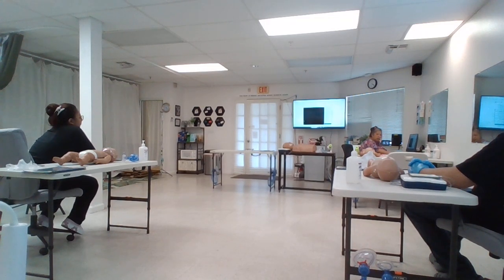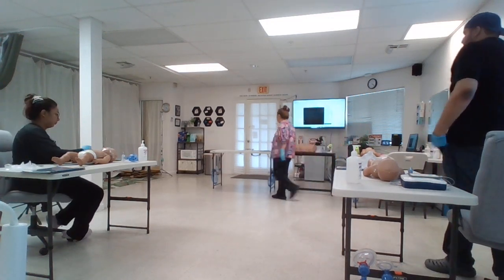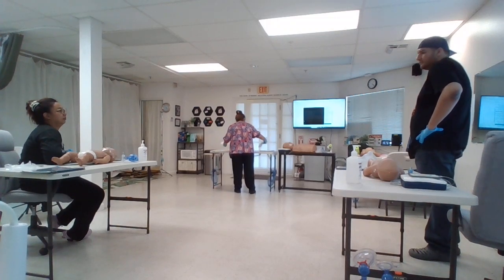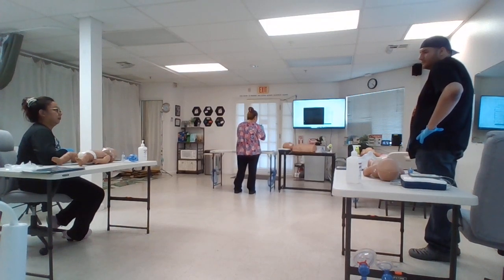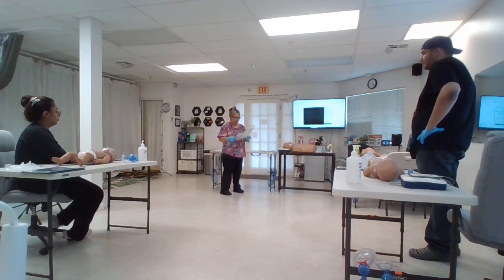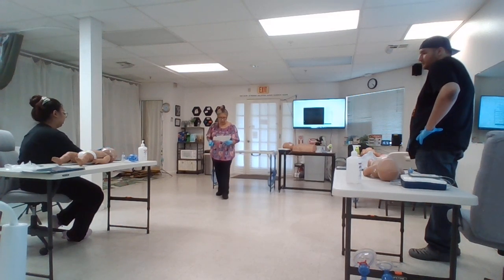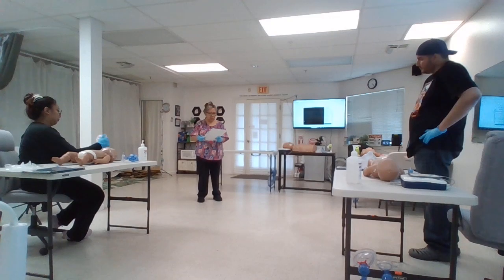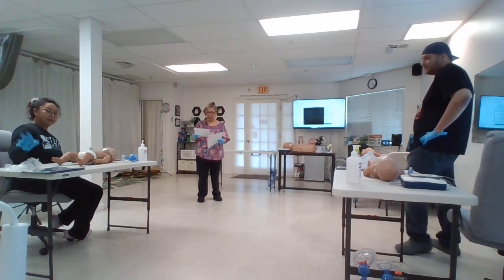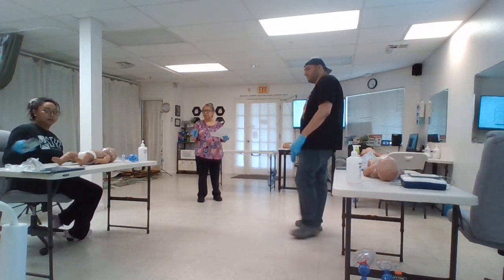And now, are you guys ready to test your skills? Okay. So first, I'll be testing one person as the first responder, and the other person will be the second responder using the bag mask device. So who wants to be the first responder? Okay, Edward first. You'll be checking for responsiveness, checking the chest.